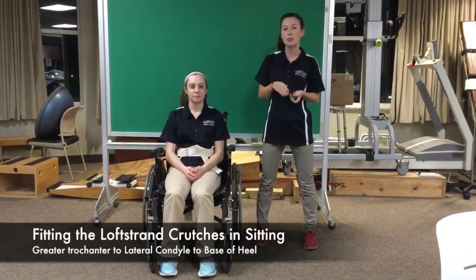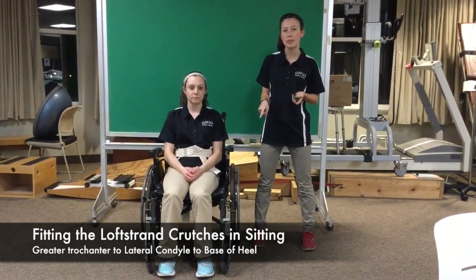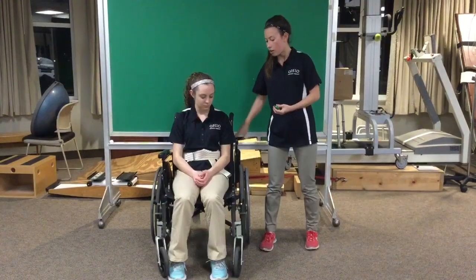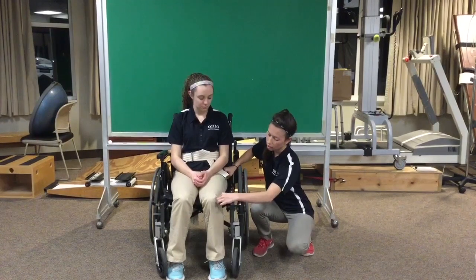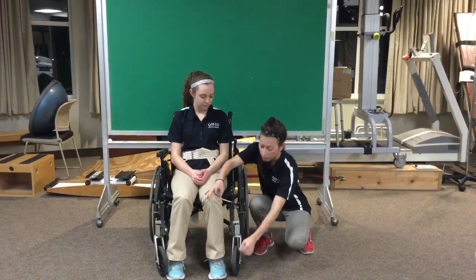To fit the lofstrand crutches, you're going to begin with your patient sitting in their wheelchair with their knees at 90 degrees, and then you're going to move the wheelchair arm. You're going to ask the patient what their height is to get an idea of what measurements should be. So Colleen, what is your height? 5'2". Then you're going to be taking two measurements: from the greater trochanter of the femur to the lateral condyle of the femur, and then from the lateral condyle down to the base of the heel.